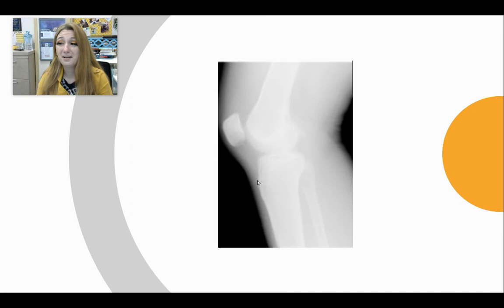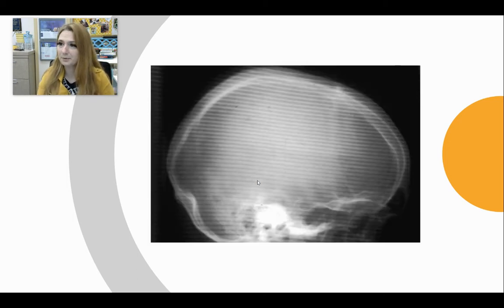This is an example of a little bit of grid cutoff, and you can see what I'm talking about. It looks kind of gray and yucky. We don't see that high contrast that we can see when everything is lined up and centered appropriately. And once in a blue moon, you might see something like this where you actually get grid lines, and that is definitely go back and repeat both of those images.